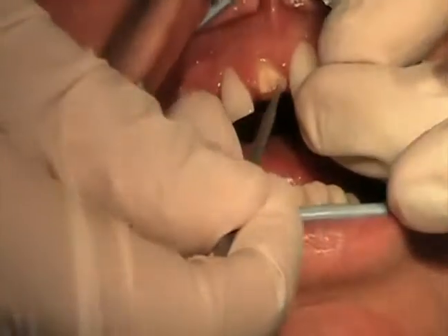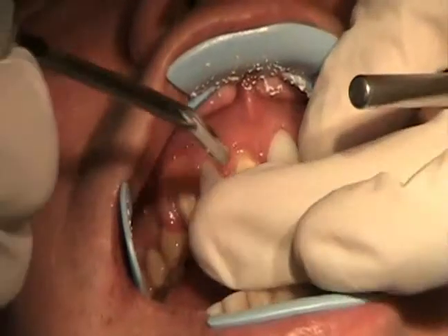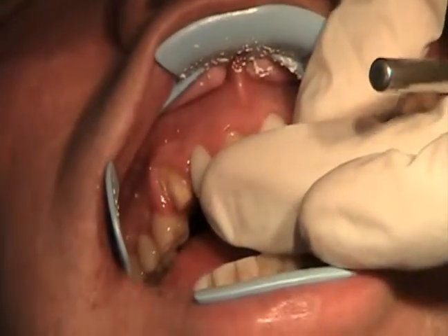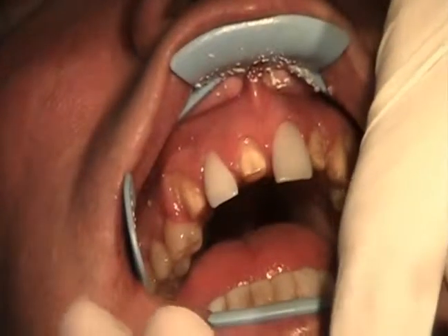So it's cementation time. We'll go ahead and put a bonding agent over the teeth. We're going to go ahead and cement that in with a resin cement. There's a little bit of adhesive properties.